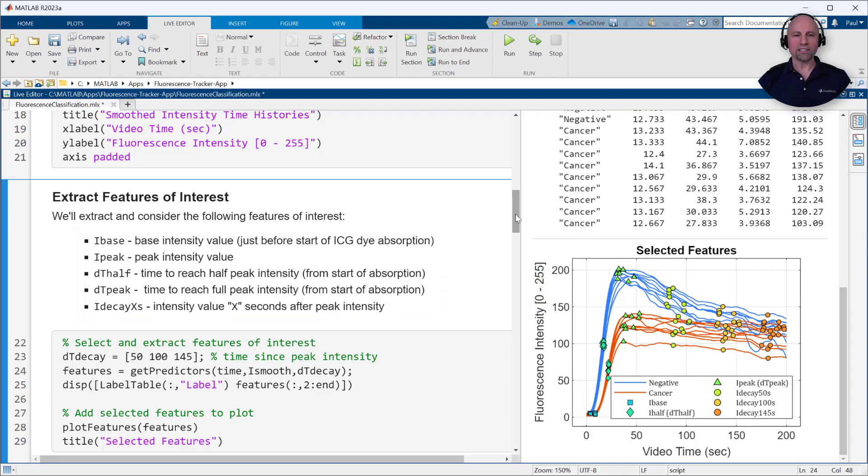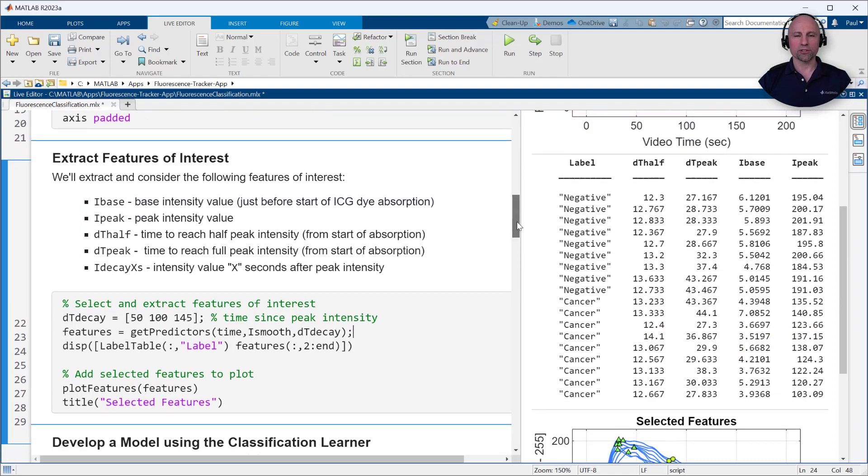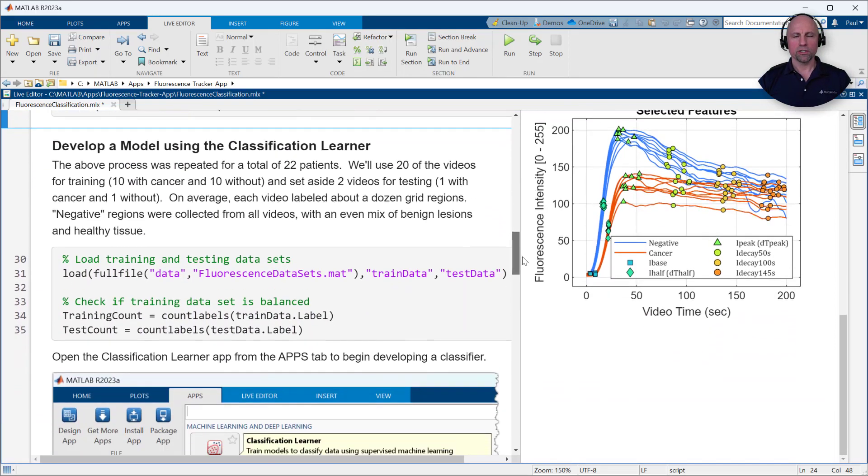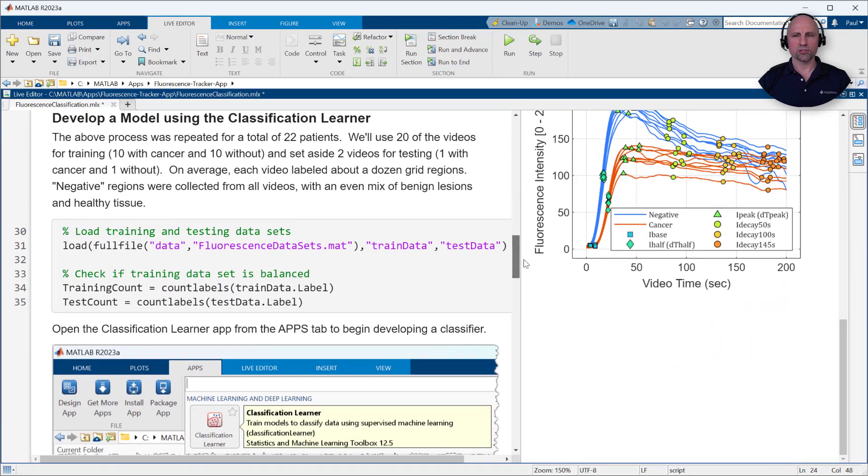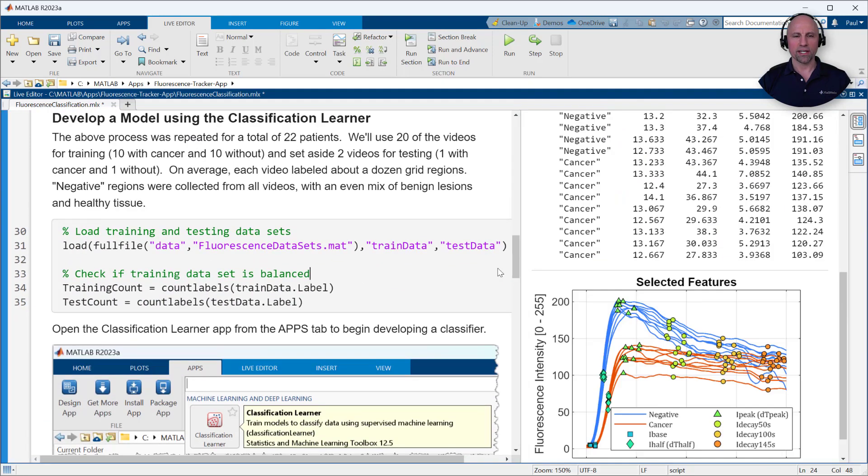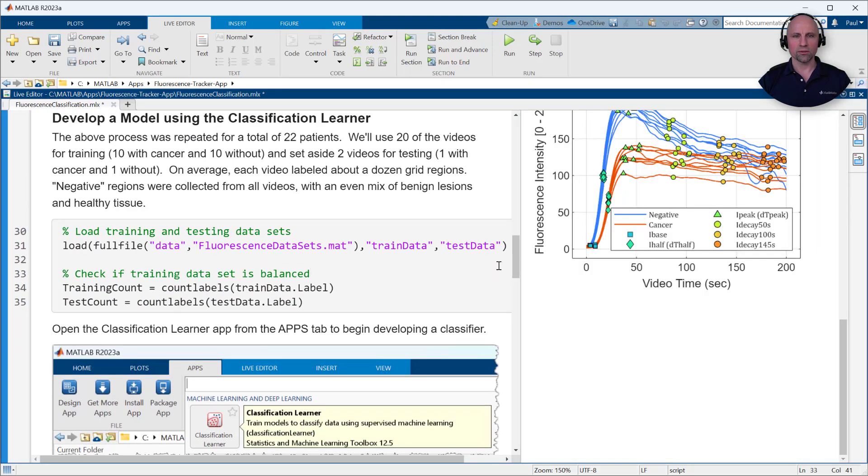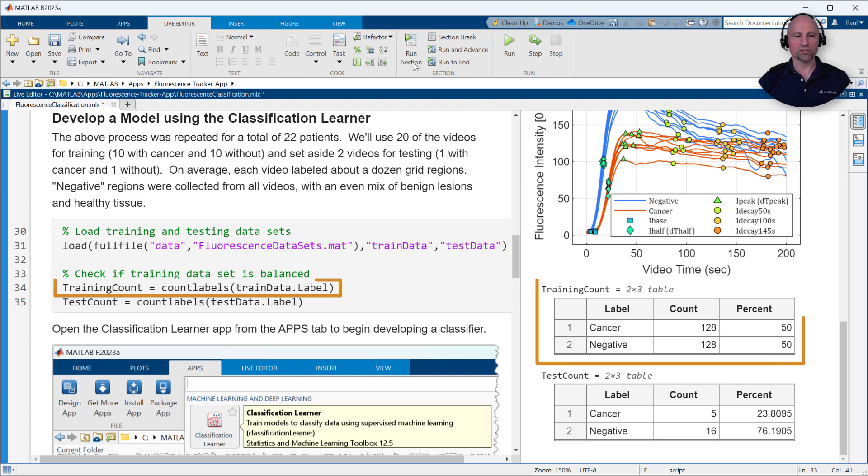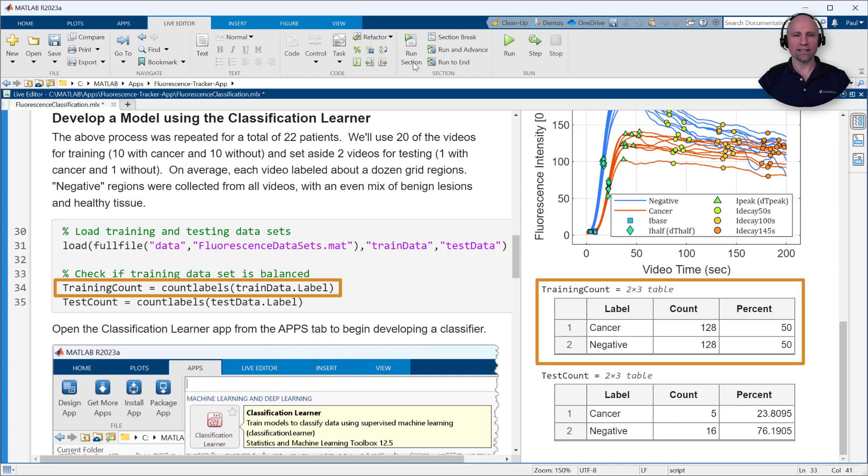The above process was repeated for a total of 22 patients. We'll use 20 of the videos for training, 10 with cancer and 10 without, and set aside two videos for testing, one with cancer and one without. On average, each video labeled about a dozen grid regions, resulting in a training dataset with 128 cancerous regions and 128 negative regions. Negative regions were collected from all videos with an even mix of benign lesions and healthy tissue.